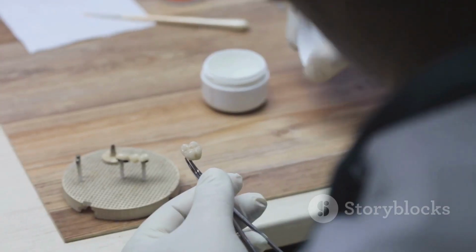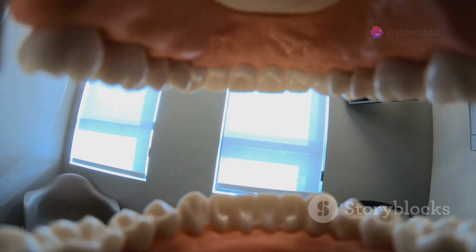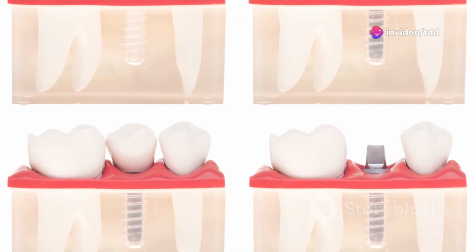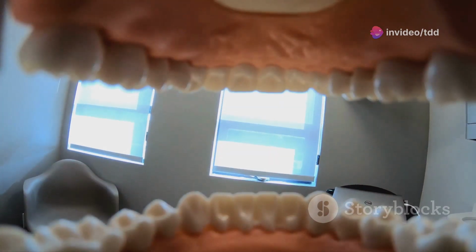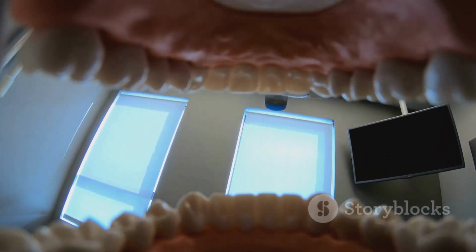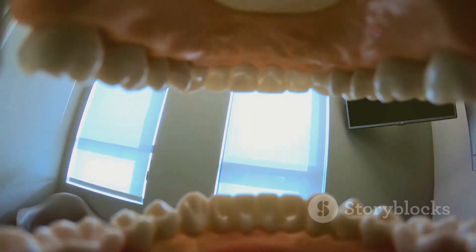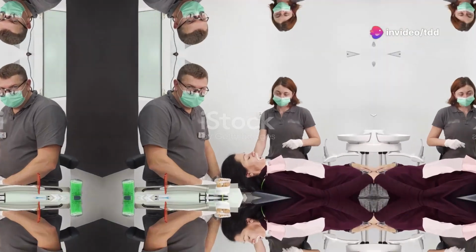Step 5. Abutment placement. Once the implant is integrated, we attach an abutment. The abutment is a small connector piece that links the implant to the crown. This is a minor procedure and usually involves 1. Exposing the implant if it was submerged, and 2. Placing the abutment and securing it with a screw.